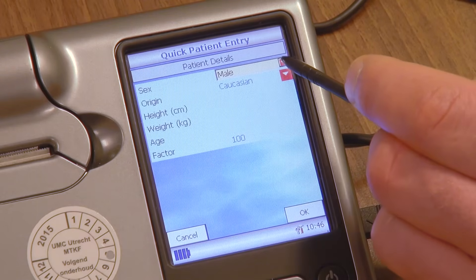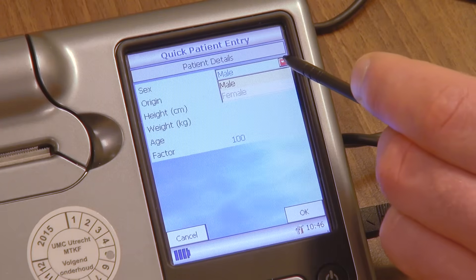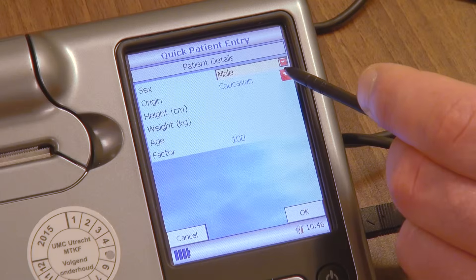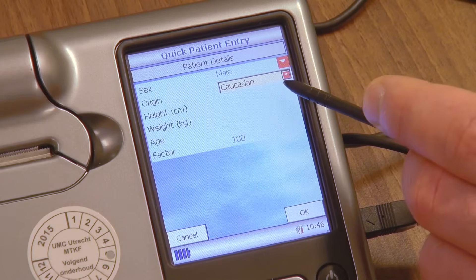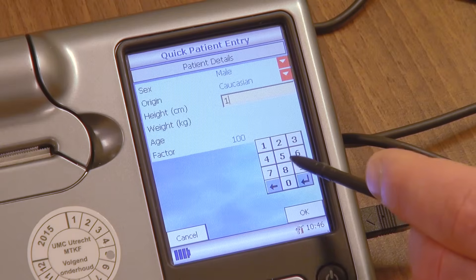Report the patient's sex by selecting from the drop-down menu. Report the patient's race by selecting from the drop-down menu. Report the patient's height by filling in the height. Units are country specific.